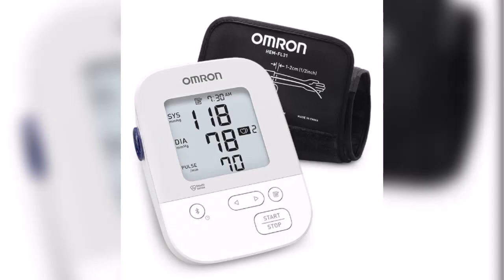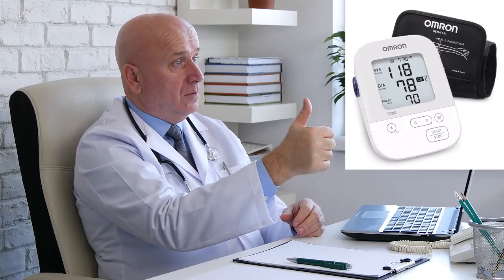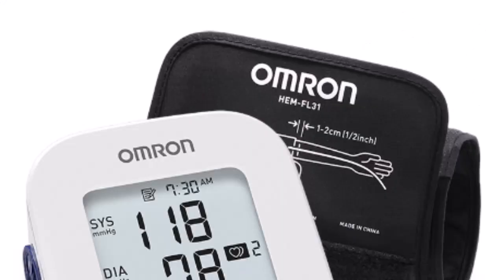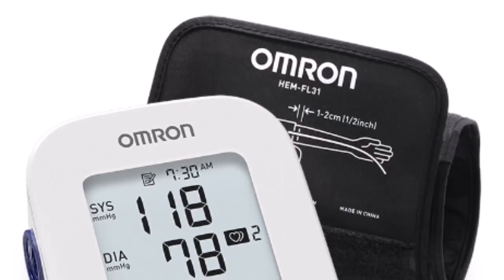We'll say goodbye to those days because the Omron Silver Blood Pressure Monitor is here to spice things up. Not only does it have a sleek silver design that will complement any home decor, but it also has advanced technology that accurately measures your blood pressure in just a few seconds.